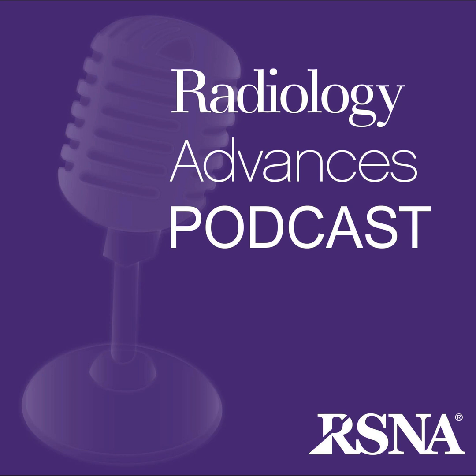So a positive finding on the unenhanced map isn't definitive by itself. Exactly. It raises suspicion strongly, perhaps, but based on these results, you couldn't hang your hat on it alone. In the study, the confirmation was the contrast-enhanced CT. In a real patient who can't get contrast, a positive unenhanced map leaves you needing another diagnostic avenue, maybe leaning more heavily on clinical probability and D-dimer, or considering VQ or MRI scans if feasible and appropriate.